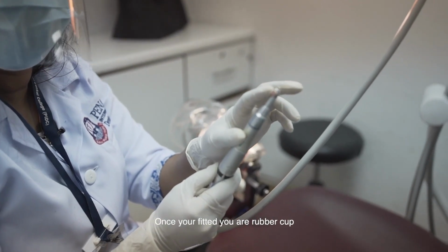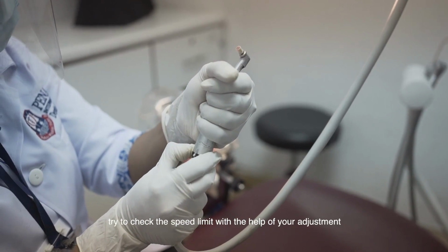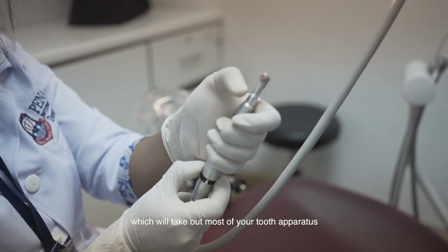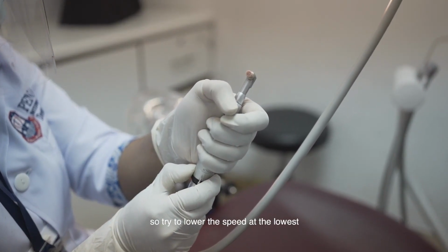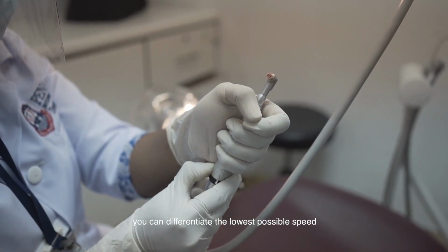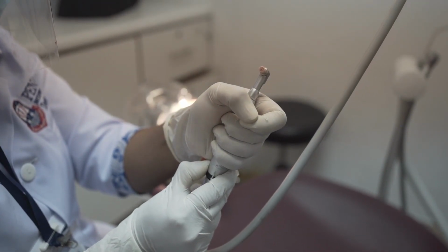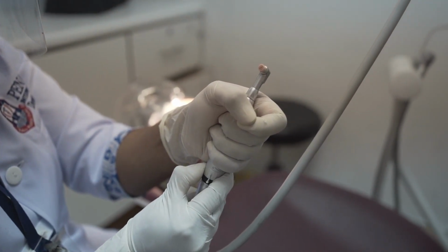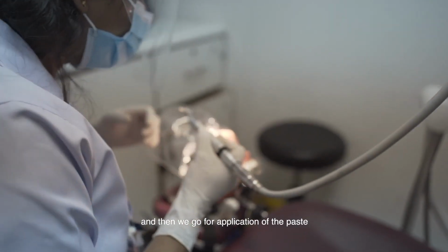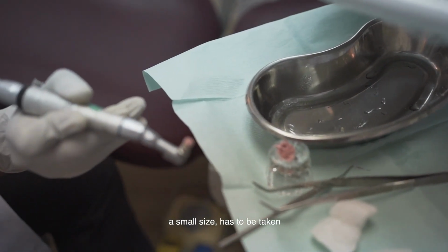Once you have fitted your rubber cup, try to check the speed limit with the help of the adjustment which is down there. This is running at almost a very high speed, which will take out most of your tooth apparatus. So try to lower the speed to the lowest possible. With the help of the sound, you can differentiate the lowest possible speed. Then we go for application, and a small size has to be taken.